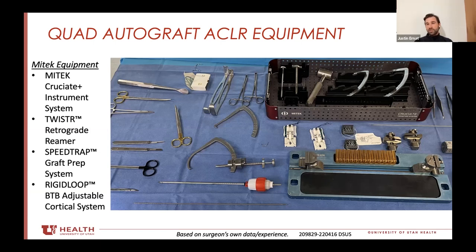I will go up to about 20 on the femoral side if it's like a 70 to 75 millimeter graft. But to be honest, most people anatomically — if you're doing an all soft tissue graft — 70 will be about the max before you start to get into muscle. If you're using a bone plug, you can get up to about 80 because you're adding 10 to 15 millimeters of bone in addition. I've never been able logistically to get a graft longer than about 75 — definitely 70 is a good win and 65 is the minimum.